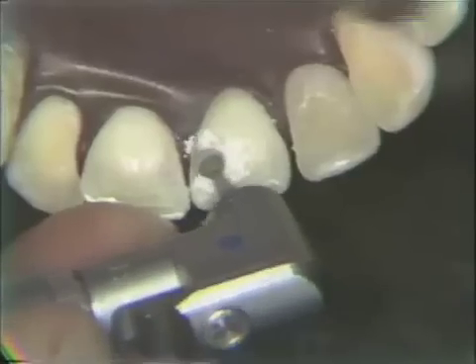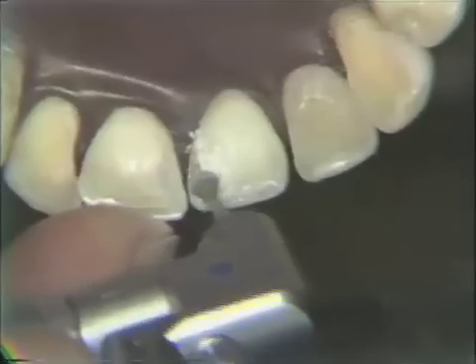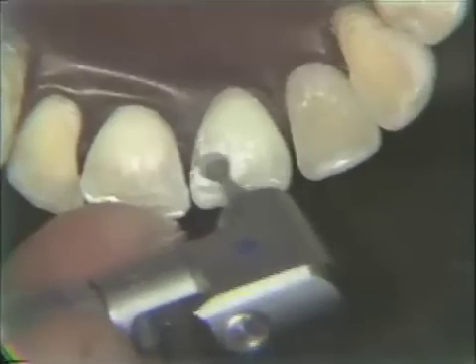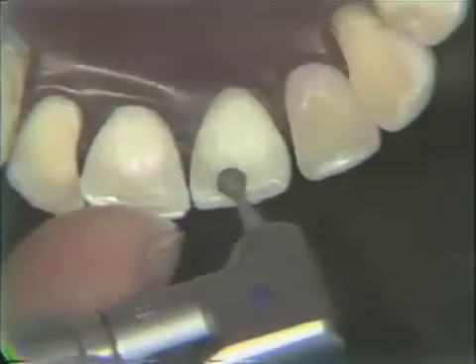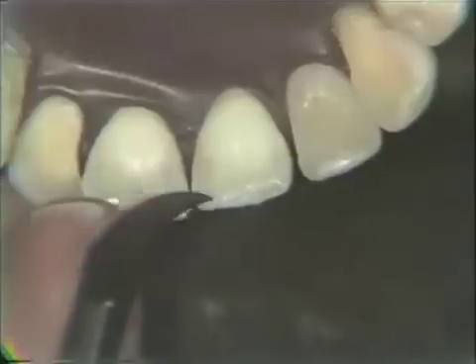You notice the on and off motion. This is true of nearly everything that we do in dentistry with a rotating instrument: on and off, not holding it in contact with the material or the tooth at all times. Taking off the excess with the green stone. You're starting now, I think, to see the cavity outline.